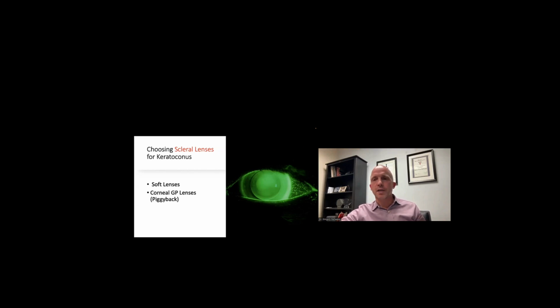I think the soft lens, hopefully, if they can wear a daily disposable contact lens, not only improves the fit on many patients, but it certainly enhances the comfort. And it also acts to protect the cornea if we happen to have an area of bearing with that type of fit. Hybrid contact lenses are an option.